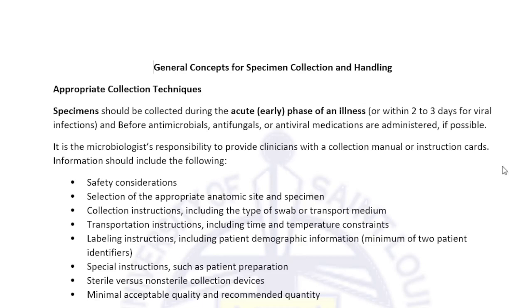Okay, so this is the third topic for our discussion back to laboratory. The third one is about the general concepts for specimen collection and handling. So we'll discuss the appropriate collection techniques.